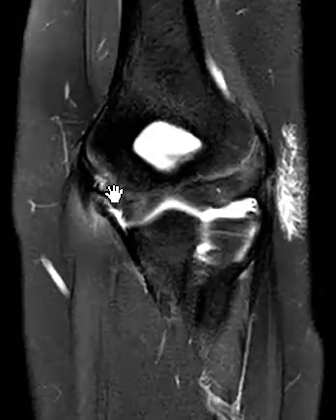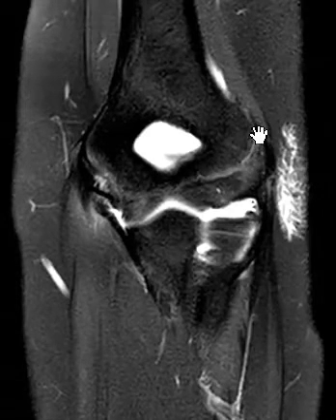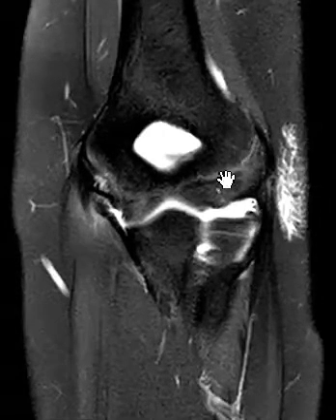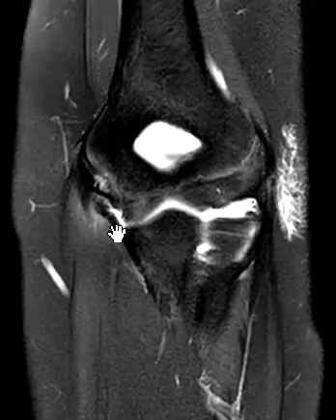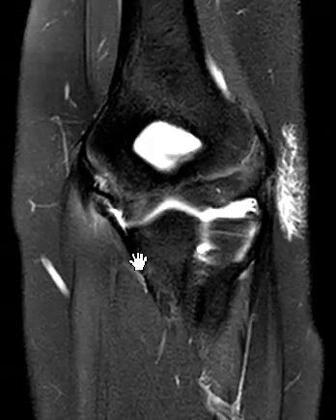Right here, there's a subtle area of brightness, which is abnormal. This linear band here — this is the growth plate. You can sometimes have a little signal adjacent to the growth plate in growing patients, but this is just too much, and it's right where that UCL attaches. So really just on this image and this image, we see the problem.